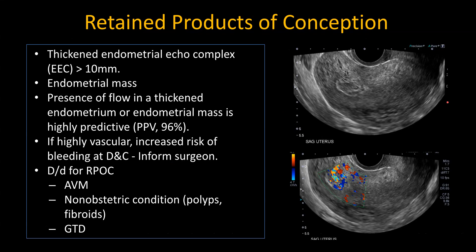On ultrasound, the findings of retained products of conception include a thickened heterogeneous endometrium, usually more than 10 mm. You may see an endometrial mass which is separate from the normal endometrium. In this case, there is normal endometrium towards the periphery and an ill-defined echogenic mass. On Doppler, there is vascularity. Presence of flow in a thickened endometrium or an endometrial mass in a postpartum patient or in a patient who had early pregnancy failure presenting with bleeding would suggest retained products of conception.